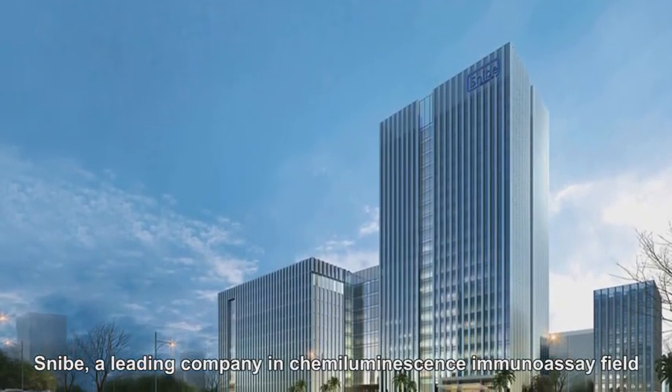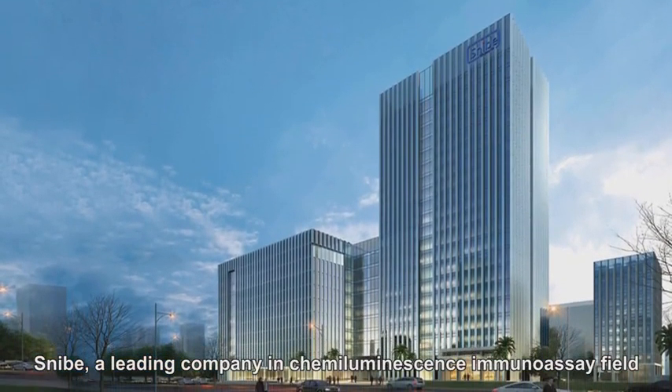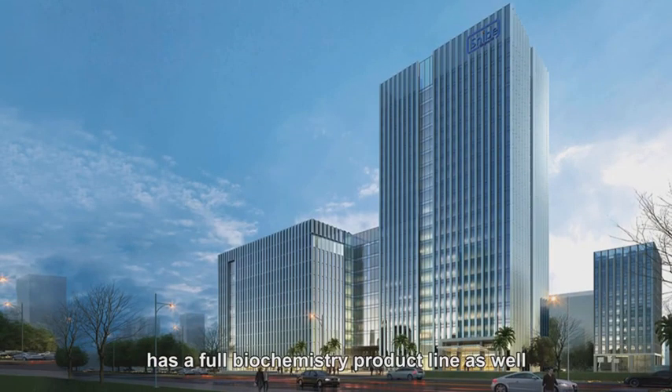Snibe, a leading company in chemiluminescence immunoassay field, has a full biochemistry product line as well.